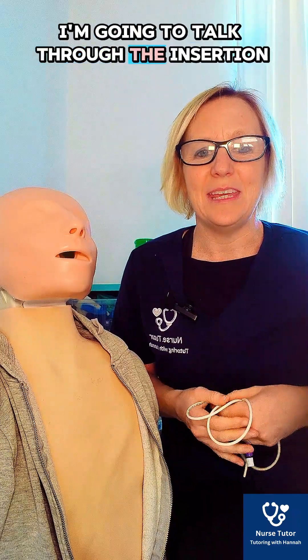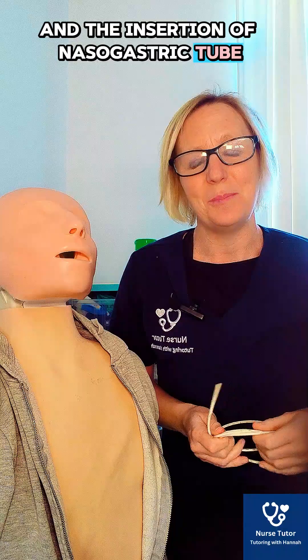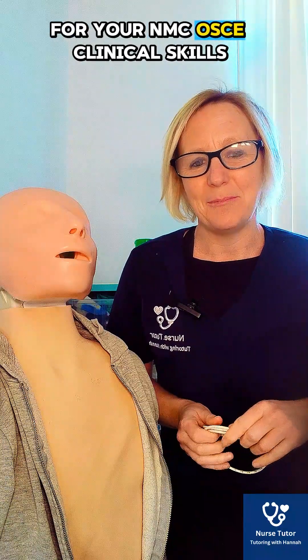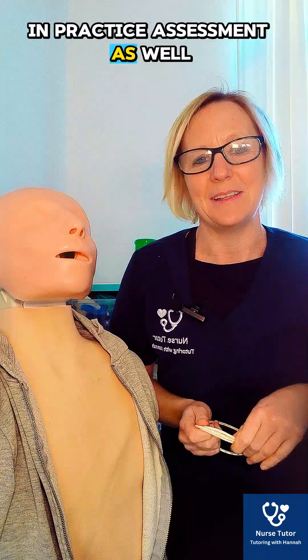Hello, welcome to this video. I'm going to talk through the measurement and insertion of a nasogastric tube for your NMC OSCE exam, clinical skills, or if you're a student nurse preparing for this in-practice assessment as well.